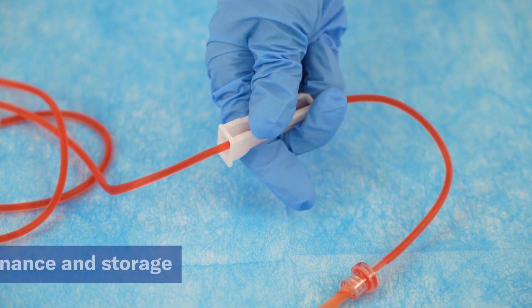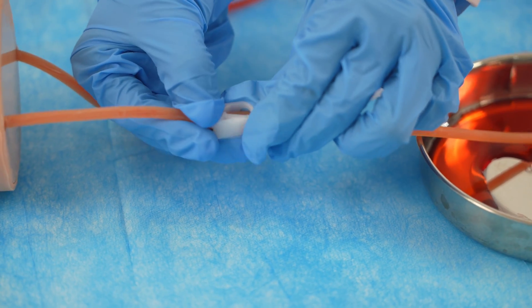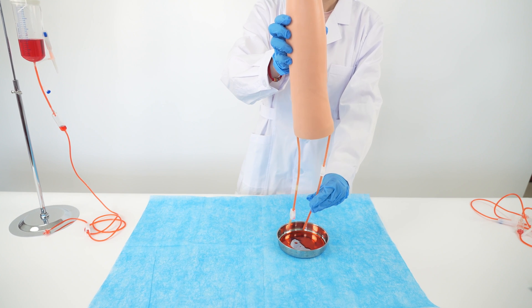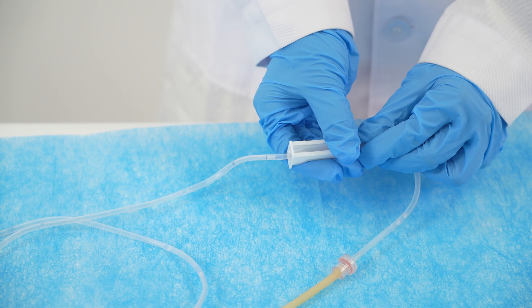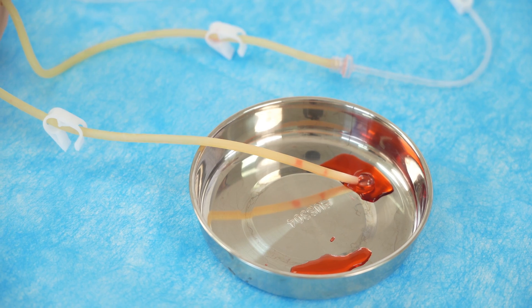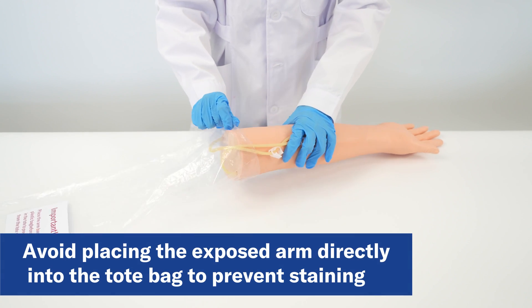At the end of the training practice session, close the roller clamp and move to a basin. Open all clamps and allow the fluid to drain into the basin. Flush the container and tubes with water and allow to drain and dry. Put the arm back in the provided plastic bag and replace the arm and all items into the blue bag.